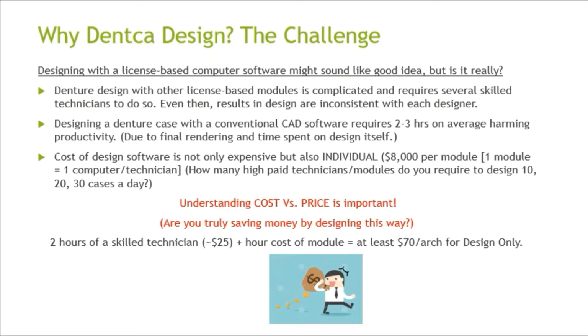This greatly harms productivity. The reason for that is because the background generation or the final rendering of the files usually takes roughly about an hour to an hour and a half. And due to the complications of designing with conventional software where you have to set each individual tooth, it makes you spend a lot of time designing conventional dentures.